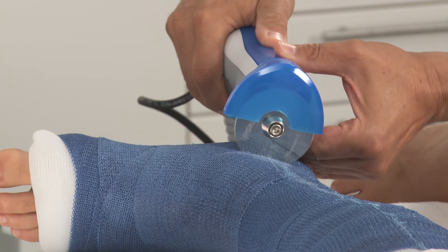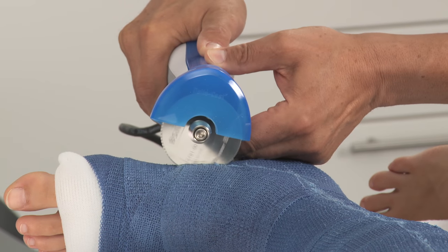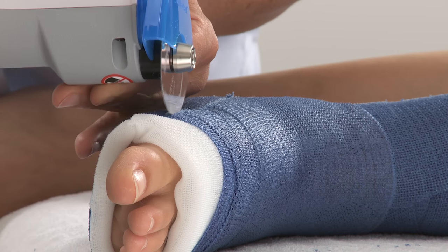Continue going distally, past the ankle along the foot. Be careful not to cut over bony prominences, such as the malleolus. Redo any parts that may not have come apart.